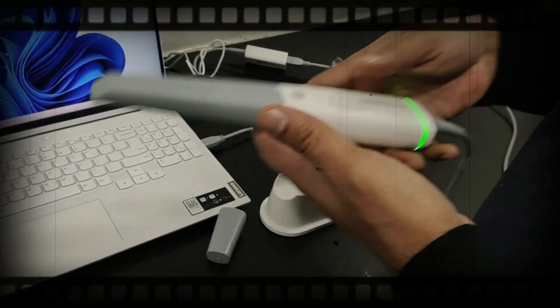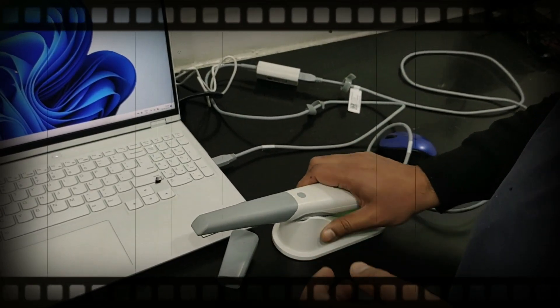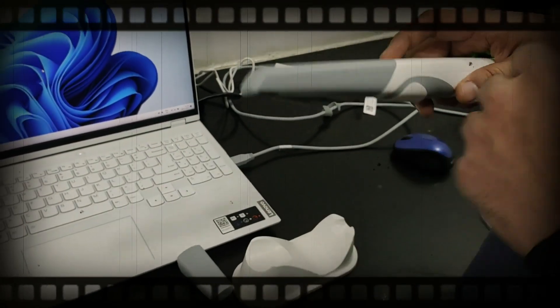The advantage of this scanner is that it is very lightweight and it has a single button. Once you keep it on the stand, it automatically pauses, and as you lift it up, it automatically restarts.